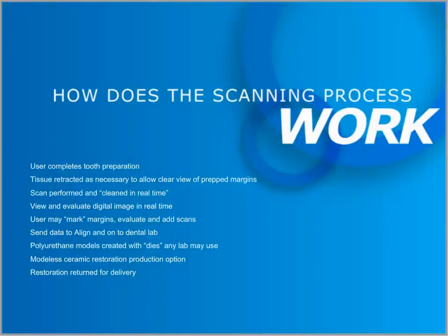Now, how does the process itself work? Well, it's just the way that we do it for conventional. We'll cut a prep, we'll retract the tissue, we'll scan. The scan is then cleaned up in the virtual world in real time. We'll view and evaluate the digital image in real time. The user may mark the margins, evaluate and add scans. The data is then sent to, in this case, Align Technology or onto a dental lab of some kind, maybe Glidewell or whoever that might be.